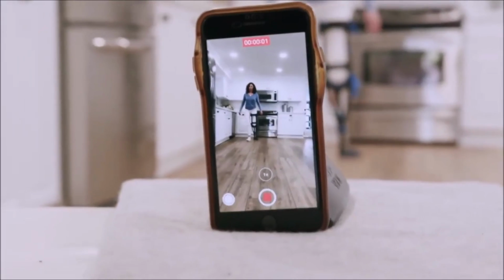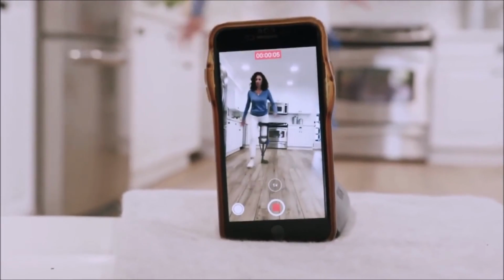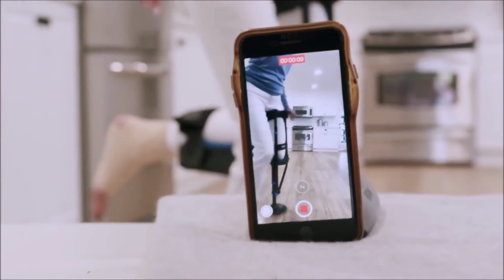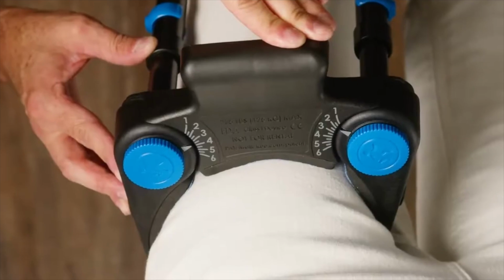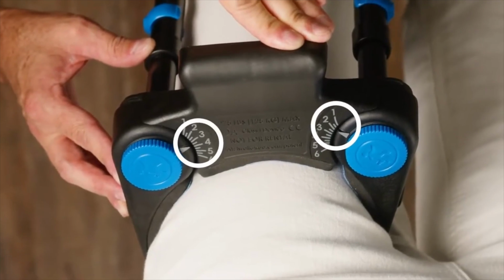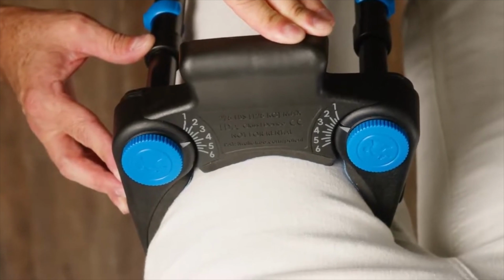Position the camera so that we can see the user from head to foot for the duration of the video. Record them taking at least 5 steps towards the camera, then turn around and take at least 5 steps away from the camera. Also, please provide a picture of the thigh support settings as shown here. We need to see this perspective, so we can identify the numbered adjustment settings of the thigh supports. Note that the numbered settings don't need to be the same on each side.